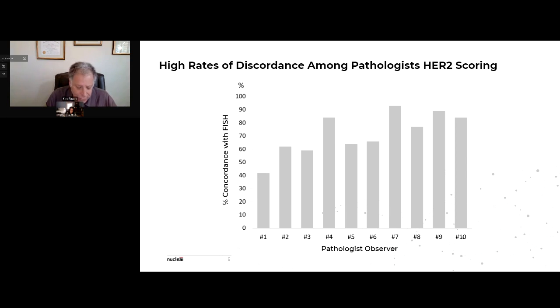Unfortunately, interpathologist variability in the interpretation of HER2 turned out to be worse than the variability we saw 15 years earlier in the Central Pathology Laboratory of the National Bladder Cancer Project. This chart is from a study that I performed on behalf of Chromavision, one of the first digital pathology companies. 10 pathologists reviewed the same 100 immunostained HER2 slides and scored them as 0, 1+, 2+, or 3+, according to the guidelines in the package insert of HercepTest.